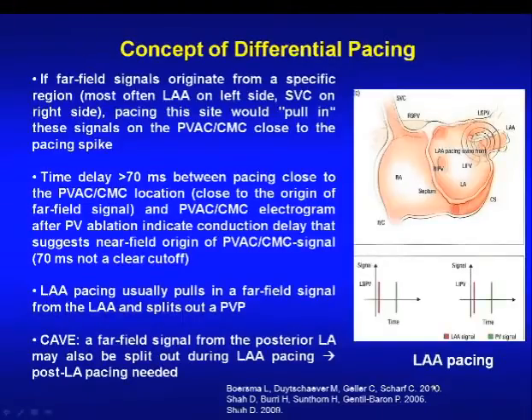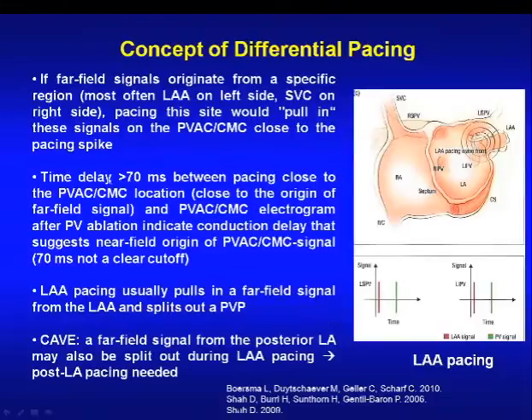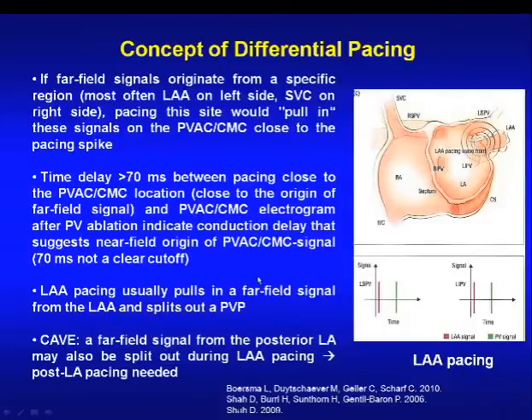To summarize differential pacing: if a far-field signal originates from a specific region, pacing that site will pull the signals on your PV mapping catheter close to the pacing spike. A time delay between the pacing spike and the electrogram indicates a conduction delay suggesting a near-field PV origin. A cutoff of 70 milliseconds is used, though it is not absolute, and you may need to pace more than one location around the pulmonary vein ostium.